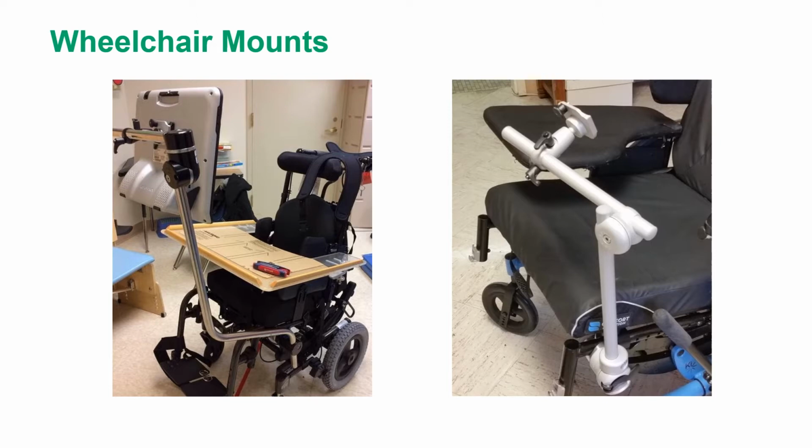The wheelchair mount can come in many different styles and components. The mount style and components are guided by the type of wheelchair and by the preferences of the AAC device user. So to recap, there are three types of AAC device mounts, which include table mounts, floor mounts, and wheelchair mounts.